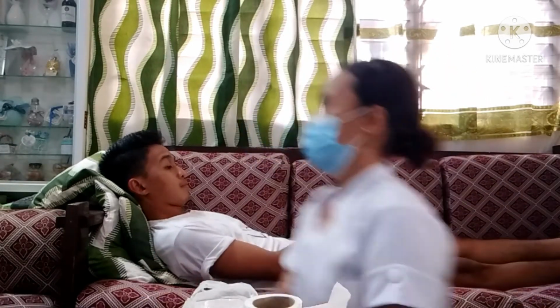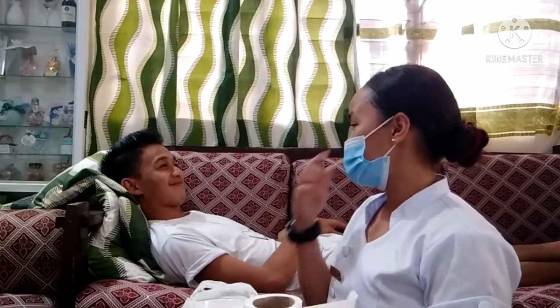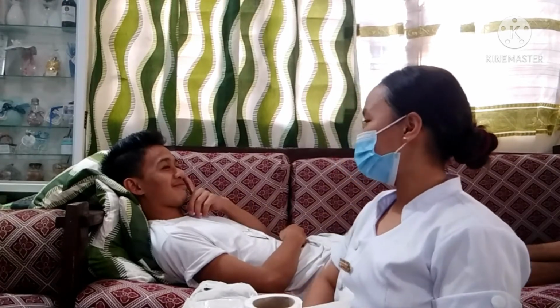Explain the procedure to the patient to gain cooperation and allay anxiety. So, sir, good afternoon. We're going to instill medication through your nose as prescribed by the doctor. Is that okay?